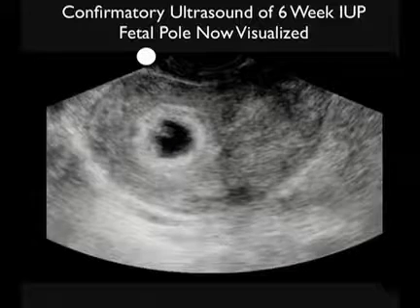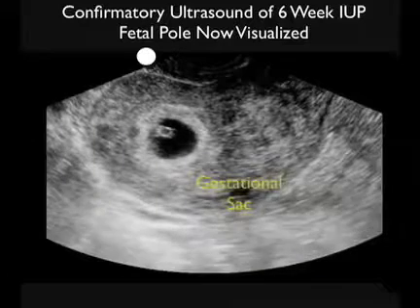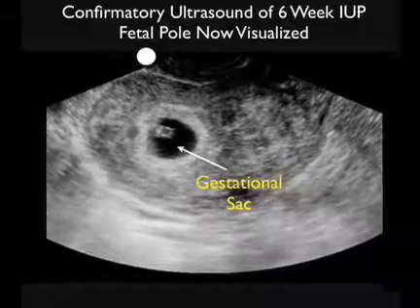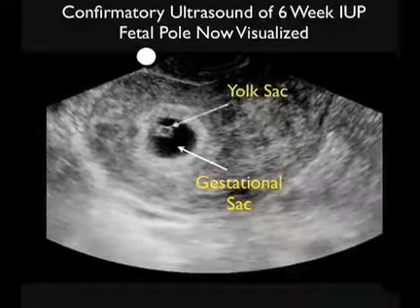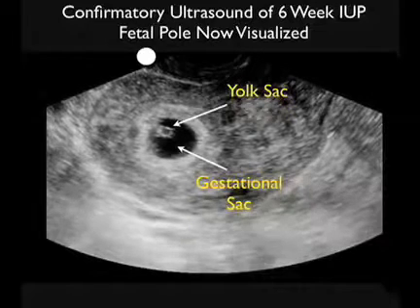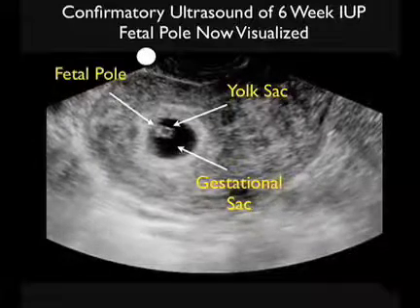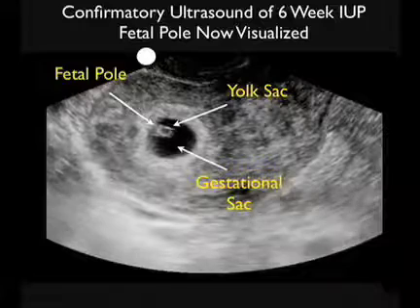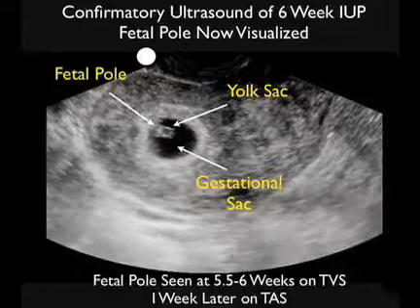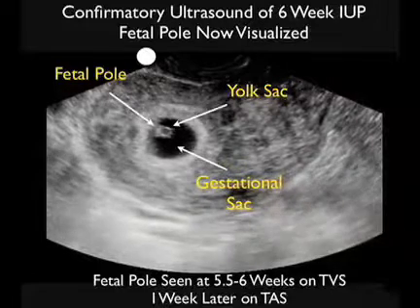Here's a pregnancy that's a little bit more advanced, and here we see a large round gestational sac, that dark or anechoic structure, and inside the gestational sac we can see the circular yolk sac or Cheerio sign. And let's look just to the left of the yolk sac here, and now we appreciate the presence of a tiny fetal pole. Interestingly enough, when we magnified the fetal pole, we could actually see a tiny heartbeat. Now, the fetal pole is generally seen at about 5.5 to 6 weeks on transvaginal sonography and 1 week later on transabdominal sonography.